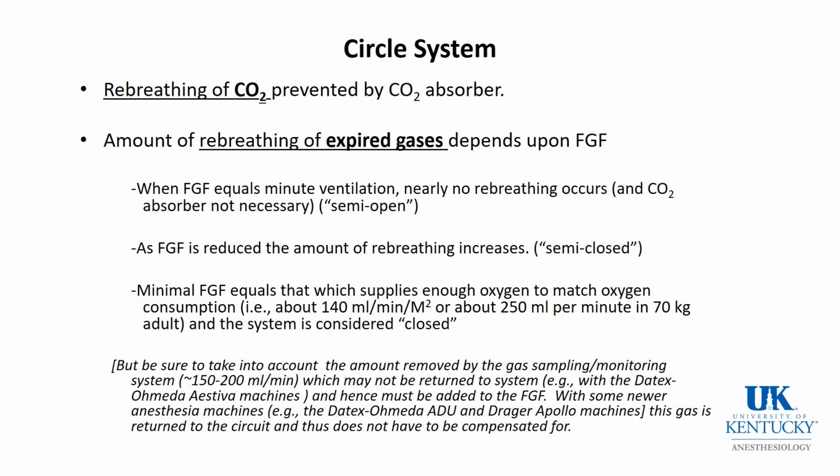But as the fresh gas flow reduces, more and more of what the patient breathes is their expired gases. And of course, their expired gases have both the oxygen and the anesthetic vapors removed from them. And so what the patient gets is no longer directly related to what you're dialing in, but how much they're rebreathing expired gases.